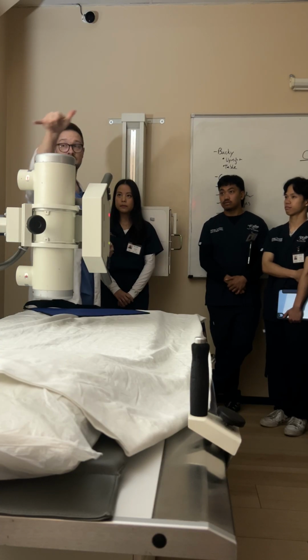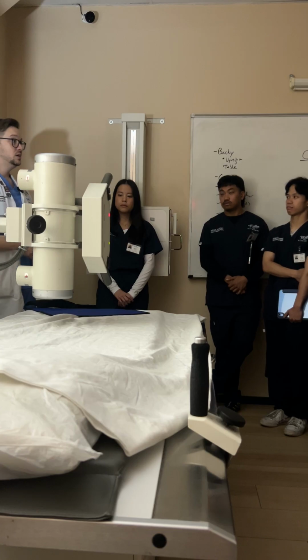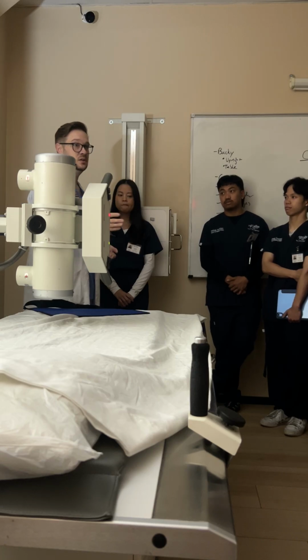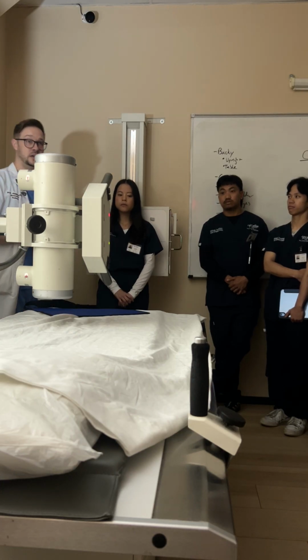Because my hand is huge compared to Victoria's hand, right? So my distance between here and here is going to be longer probably than the distance on her hand. So for me, I get more specific with each patient because T7 on every patient is going to be at the same level at the inferior angle of the scapula, which will be specific to that patient, right?